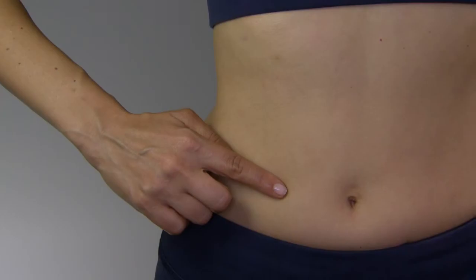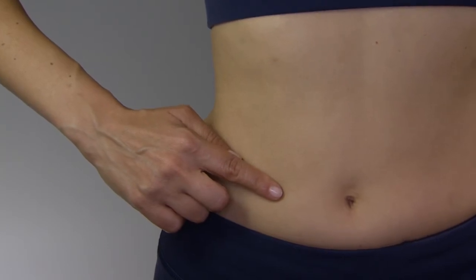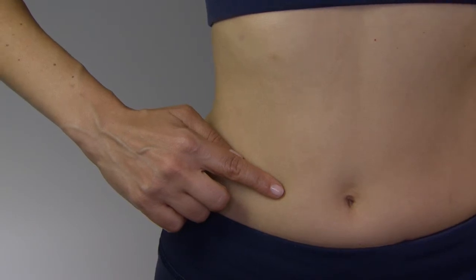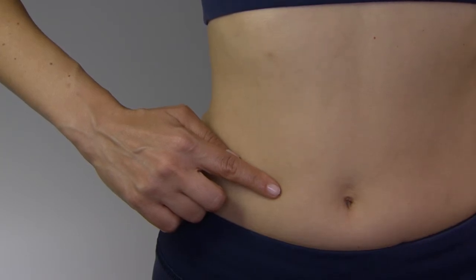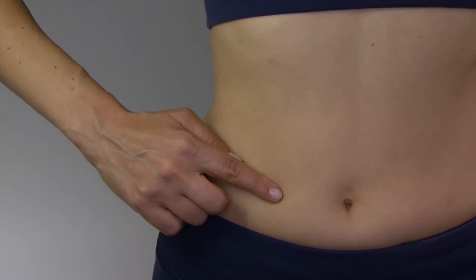Step 3. Inject. Your doctor, nurse, or pharmacist should provide you with injection training. Inject the prescribed dose as directed. Usual injection sites include the skin on the stomach, upper arm, or upper leg. Change the injection location each day to minimize discomfort. Your healthcare provider will have discussed a suitable injection site with you.